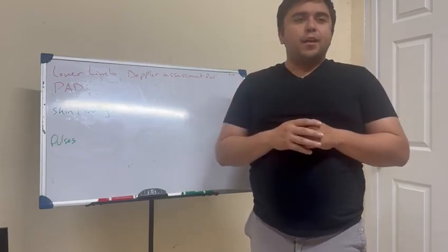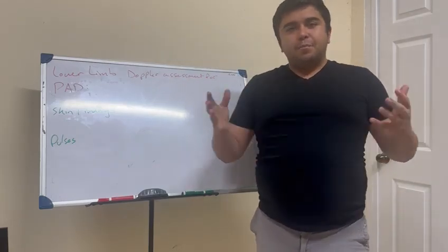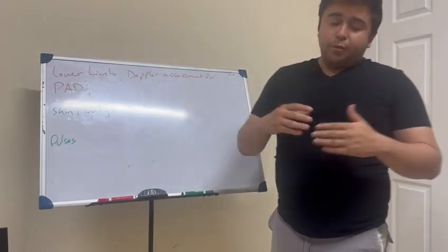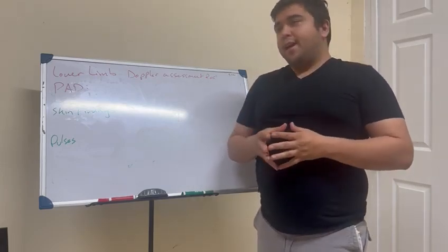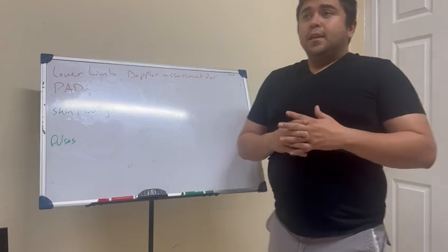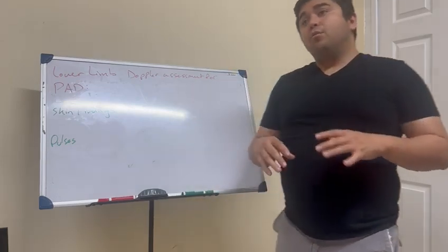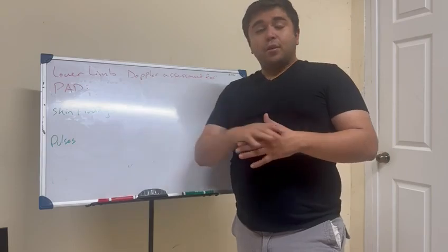Well, I just had a volunteer clinic in which I assessed over 60 patients with a Doppler and gained experience in this area. Currently I'm working with a doctor who treats diabetic foot ulcers, and so I get to see peripheral arterial disease a lot in the clinic, because sometimes the ulcers that come are not diabetic related; they're low circulation issues related, like peripheral arterial disease.